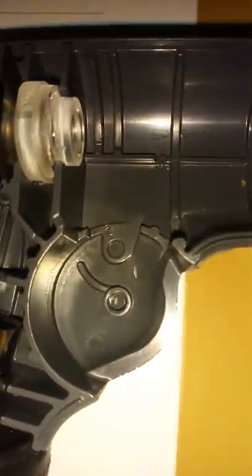So that's how that one sits in. The opposite side is the same. I won't be able to prop that up. Apologies again, I'll just leave you down there. You have to make sure you hold it quite tightly. And so now you'll see if I roll that backwards and forwards, it moves the top lens in and out. Now, holding it very carefully, the axle going in that little central part, and keeping the white line approximately straight forward, you set this back into place again.